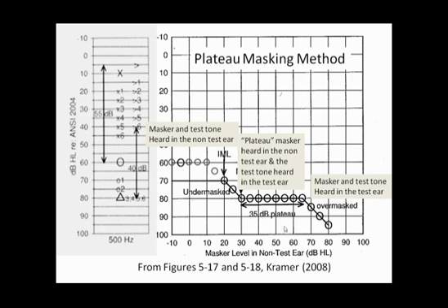And the masking noise is always delivered to the left ear, but it could be heard in the test ear due to a high presentation level and crossover. Okay, so our masked air conduction threshold is really 80 dB HL.